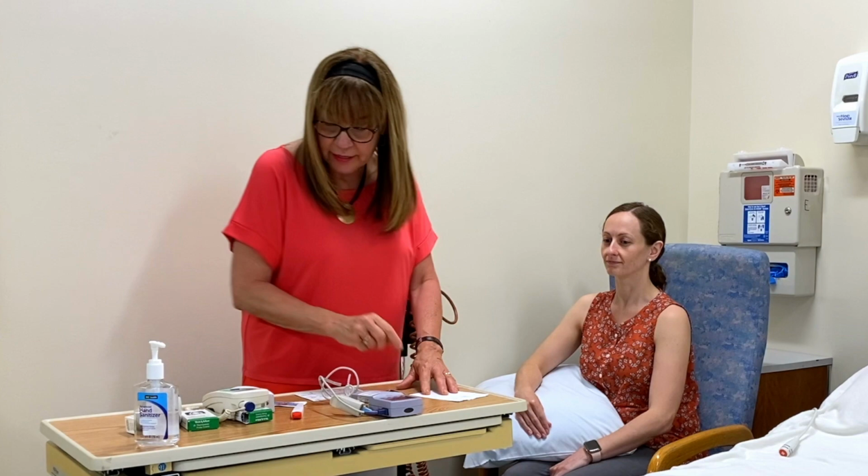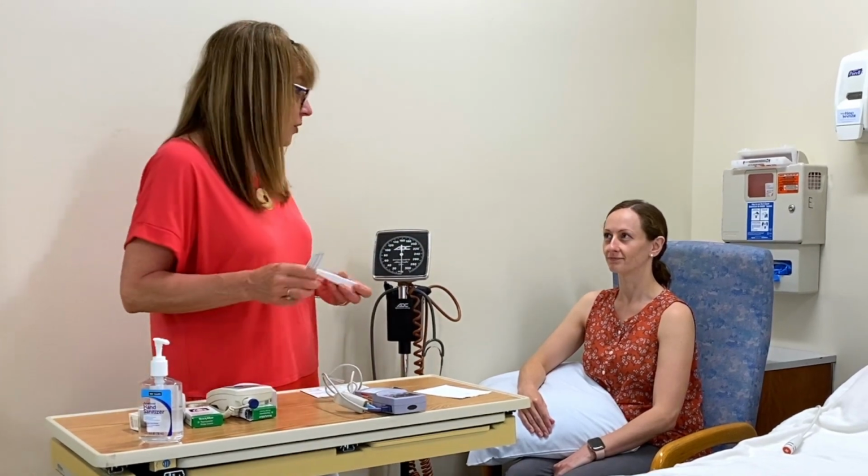Now, one way that I'm not going to demonstrate on Monique is the rectal thermometer. Rectally is the most accurate. And when you have a patient, especially that has a fever and they're breathing very heavily, you want to take it rectally.